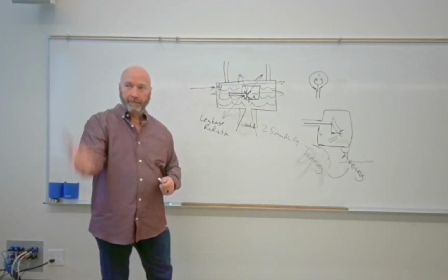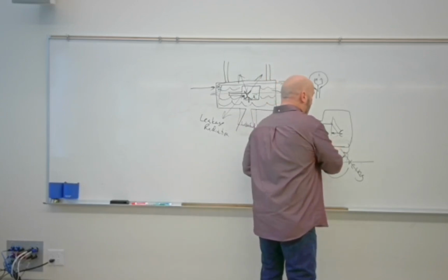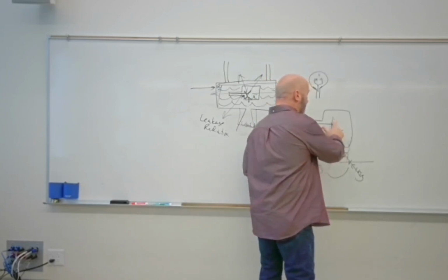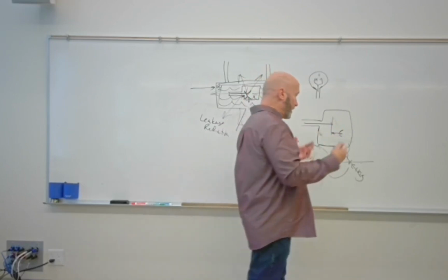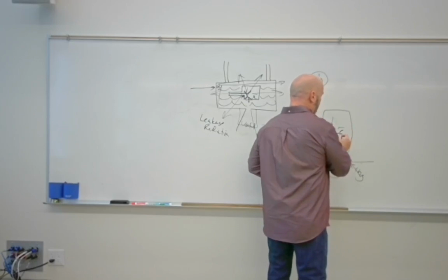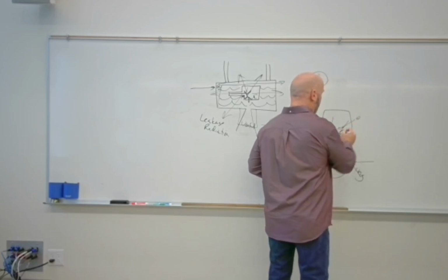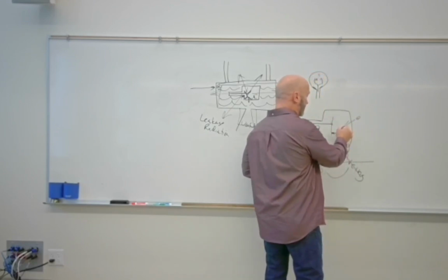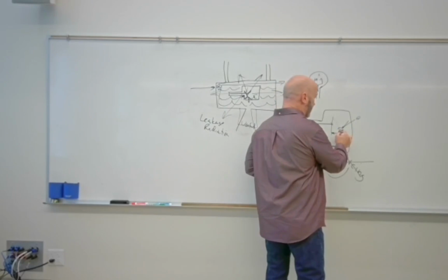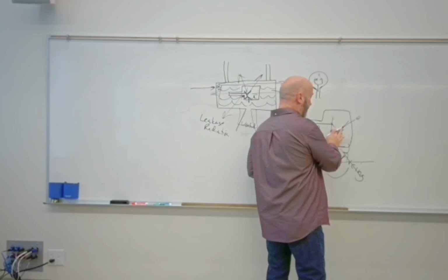Again, it's like dropping a bowling ball in a mud puddle. They're just going to go everywhere. So the focusing cup surrounds the filament on all sides except for one, so what we do is we apply a negative charge to the focusing cup to keep the electrons compressed in as much as we can, so that when we send them across the tube, we create our thermionic emissions, create our space charge, we send them across the X-ray tube, they can't spread out nearly as much.